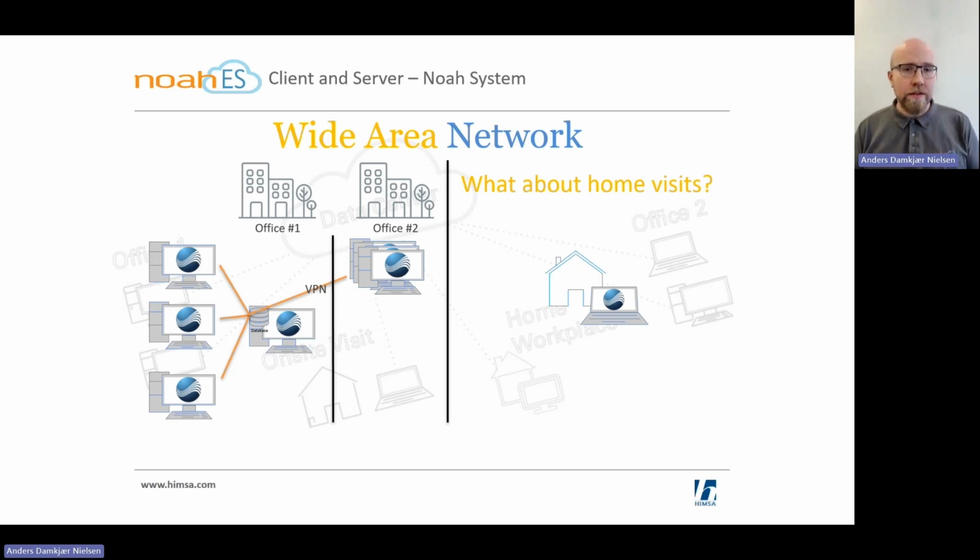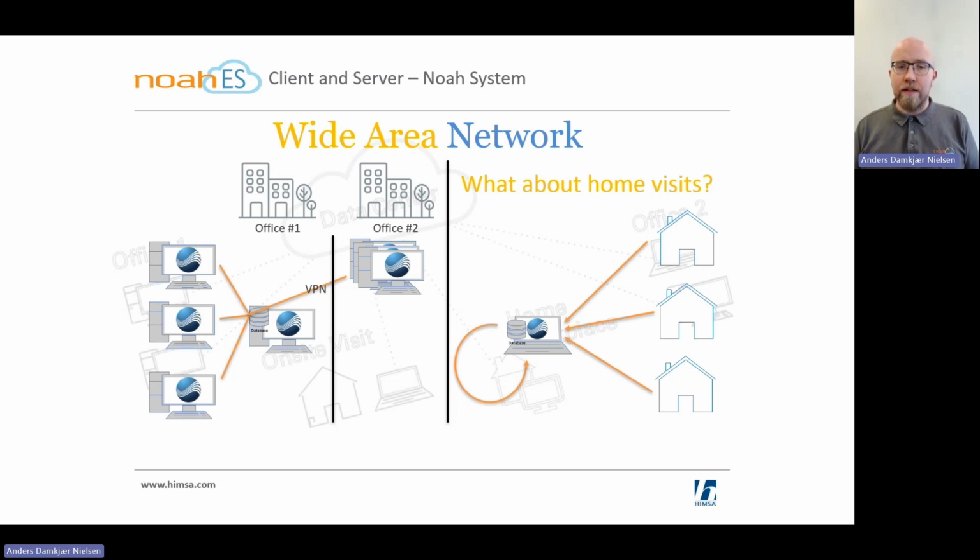If you want to do home visits, if you want to have the option to take a laptop out to visit patients either at home or to visit centers that are not your primary offices, what do you do with the data? Well, you would need to save some data from these homes, and you'd need to store them originally with Noah System on that device, which means you'd be running around with this local database that has data that's not in any of your offices.